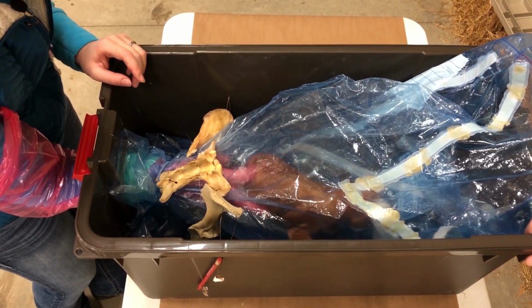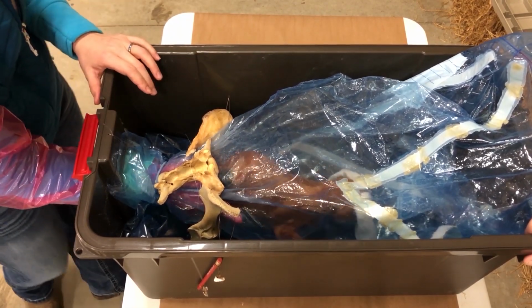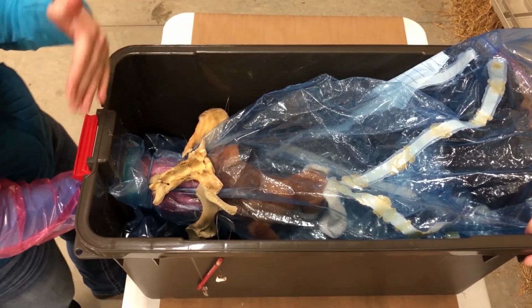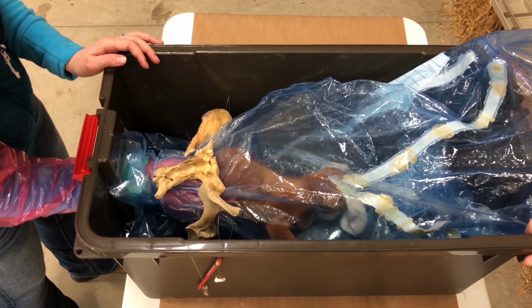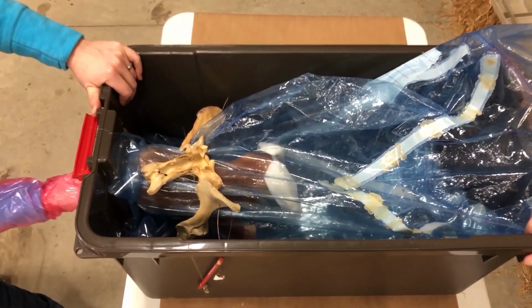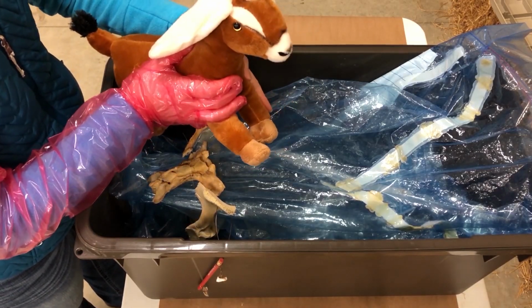So when we're pulling breech, we want to be sure we've got all 3 items: 2 back legs and a tail. When we pull, we want to be sure we're going as fast as we can. Sometimes the tails will flip up and get caught on the pelvis and the tailbone of the ewe. So you want to try and keep that down as much as possible as you're pulling this animal backwards. Like I said, we want to be as fast as possible so that the nose and mouth of the animal is back out and breathing.